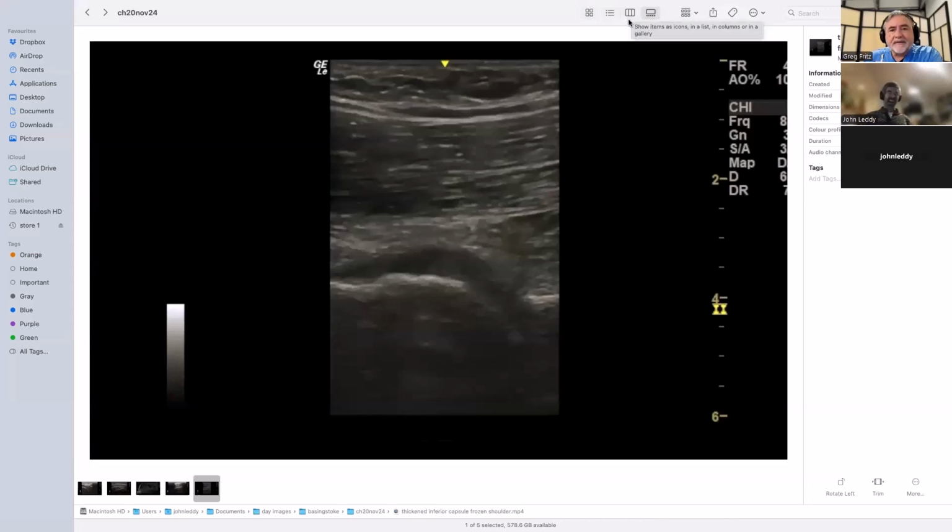I inject them with a slightly increased volume of injection. It usually depends on the size of the patient, but in a relatively small build patient, a typical lady, I would use maybe 10, 11 mils of fluid. That's less than my colleagues do, but I've not seen the evidence to justify the extra benefit of larger volumes, and it offends me how little common sense it makes, because they will often pop at that point.